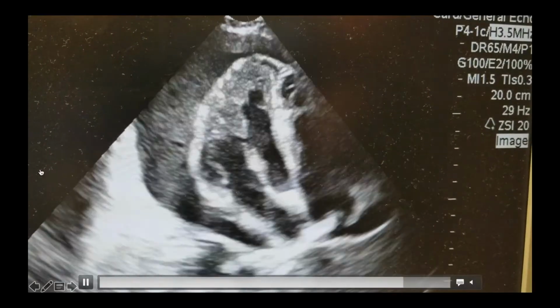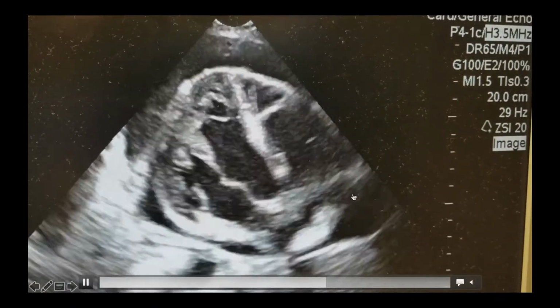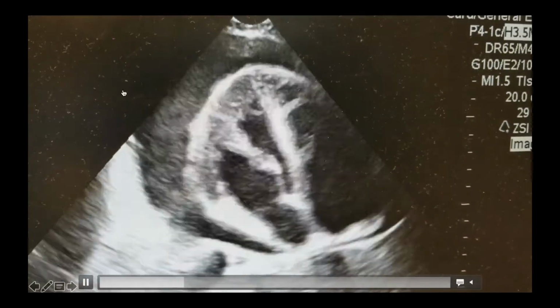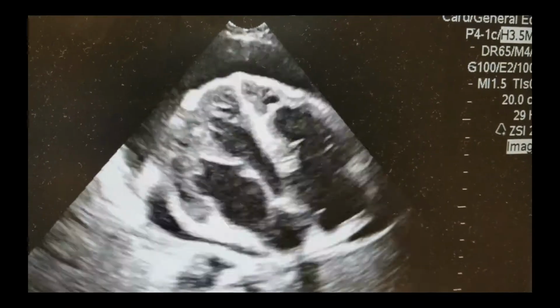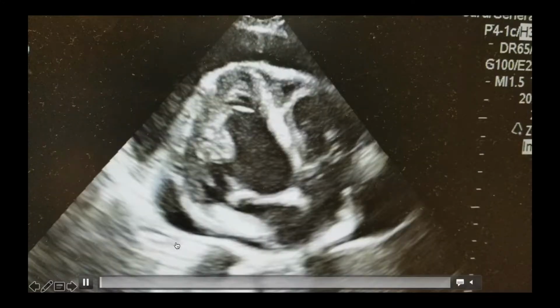Here is another very dramatic example of a pericardial effusion with concerns for tamponade. First of all, I want to point out that this swinging heart that goes back and forth is actually what causes your electrical alternans on an EKG, because the heart itself goes closer and further away from the chest wall, thereby altering your amplitudes on an EKG. All right, so let's take a look.